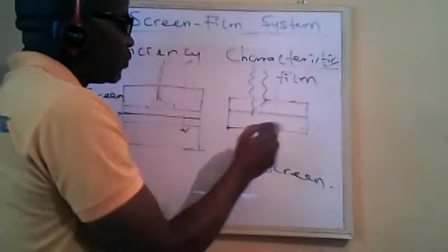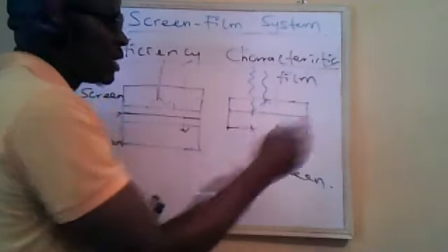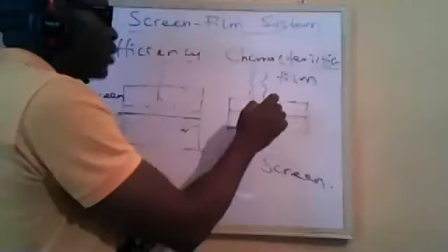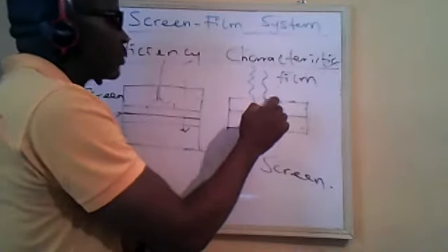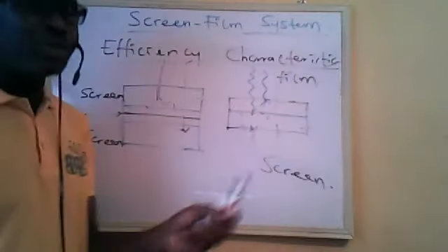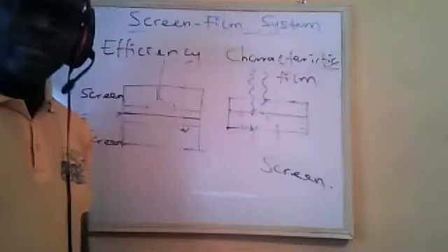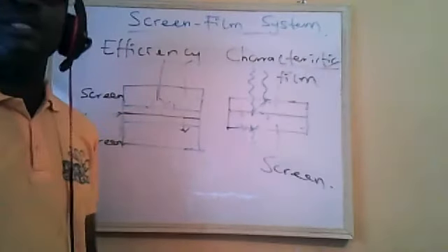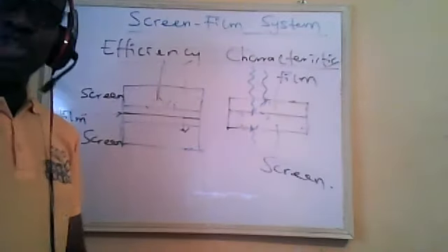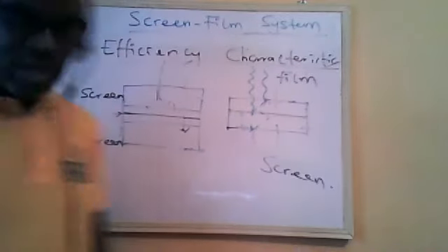Of course, then you have dispersion of light. Light will be produced here isotropically in so many directions, and then they begin to disperse. As they disperse to affect this photographic film, you can see that we have already introduced a lateral dispersion of light, which is not good for what we want to use it for. Mammography is a very sensitive modality that seeks to differentiate abnormalities in the breast tissue, which have very close contrast.